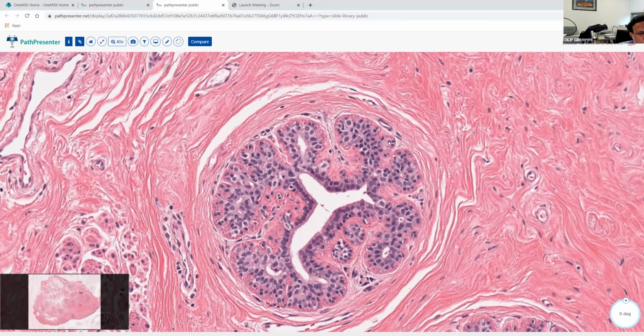Now, if you do the E-cadherin stain, you have to be mindful of what to look for, because a lot of these cells, obviously, these are all ductal cells. These will stain positive. So we have to look between those cells to look for the absence of E-cadherin. Otherwise, this can be confusing in certain situations. We probably will have some examples of that, and we will come to that discussion at that time.